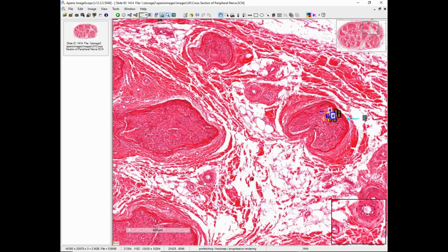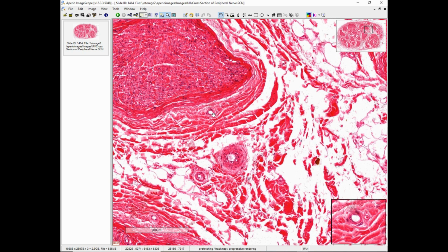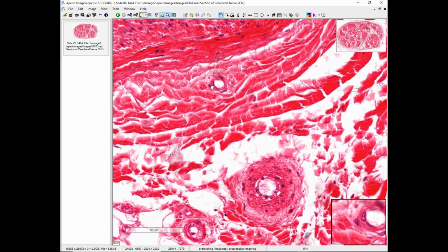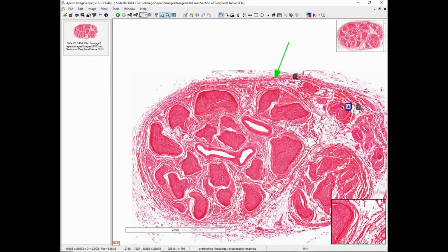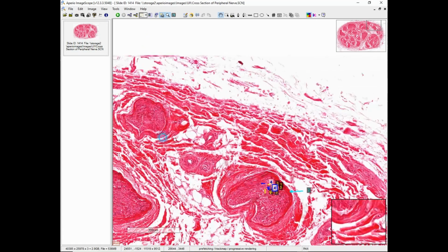And because nervous tissue is just like anything else, it needs nutrients, so we're always going to find blood vessels, maybe small little capillaries, getting close to capillary size here, larger vessels, and sometimes even quite large vessels, like this nice big artery here with its multiple layers of smooth muscle just outside the lumen there. And here, now that we've seen all that, we'll just do a quick little view here of the labeled structures.